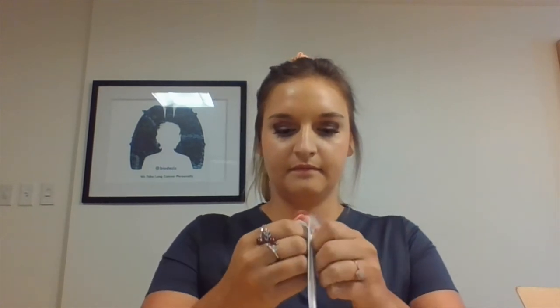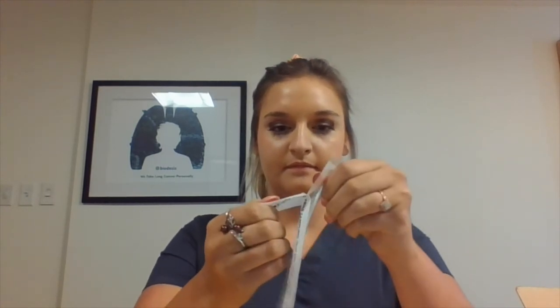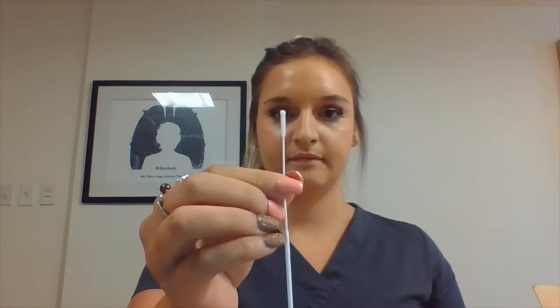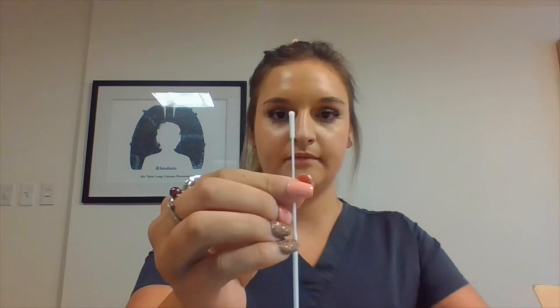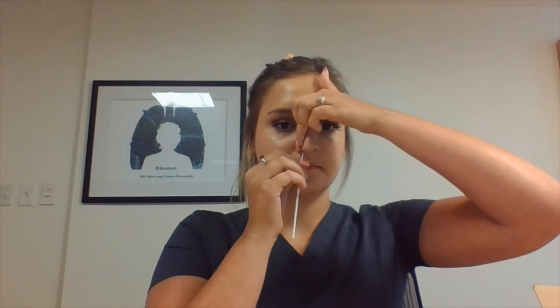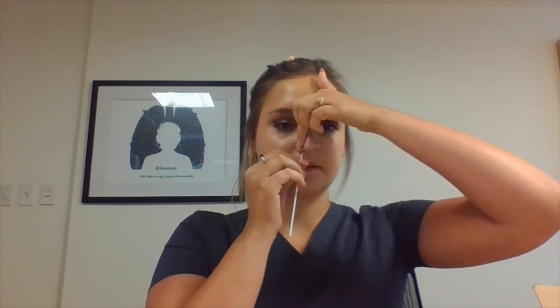To collect your sample, slowly open the nasal swab packet, much like opening a band-aid. Without touching the tip of the swab, grip the swab approximately four inches from the soft tip. Insert the swab into one of your nostrils. If you feel resistance, you have gone far enough. Place your index finger on the outside of the nostril and apply gentle pressure while you rub the swab in a circle four times.